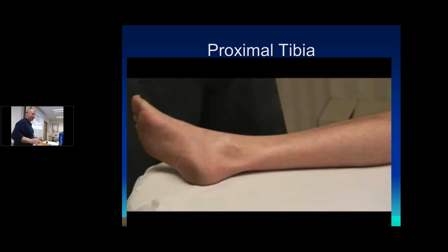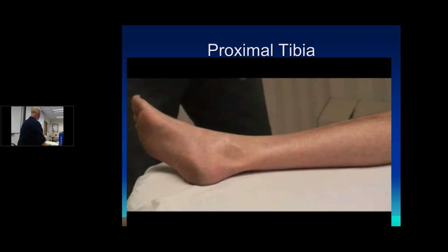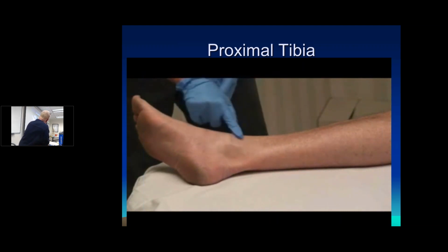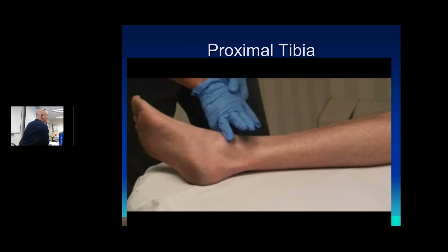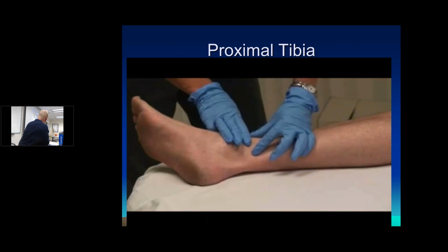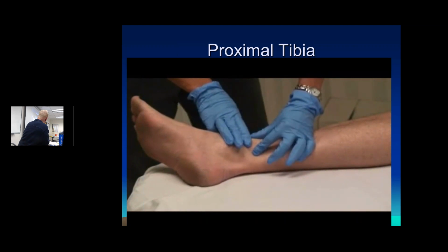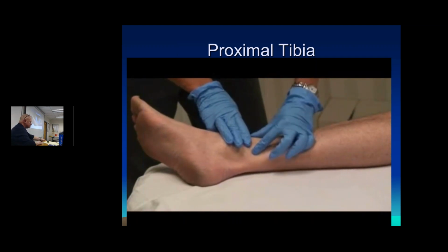All right, proximal tibia. Take a look. The next landmark that we're going to use is our distal tibia. Will you identify the medial malleolus, the ankle bone? The clinician is going to put his ring finger on that medial malleolus, two fingers' width up, making sure you're on that nice flat section of the tibia. A great way to do it is to isolate the bone on either side with your fingers so you make sure you're not too posterior or too anterior on the bone.